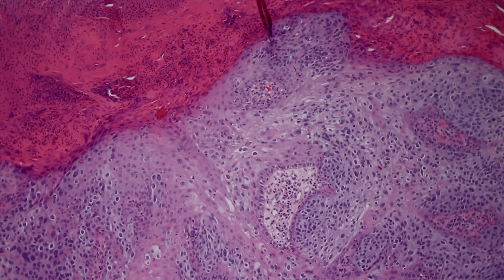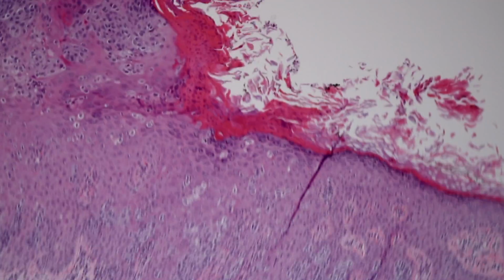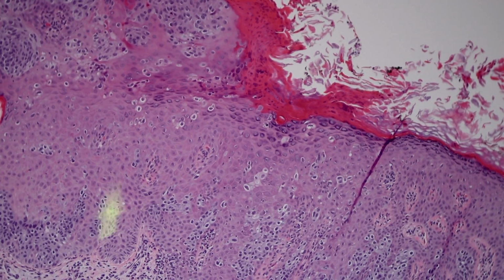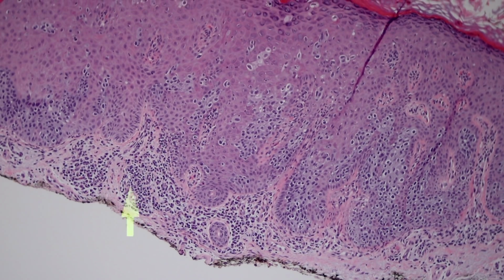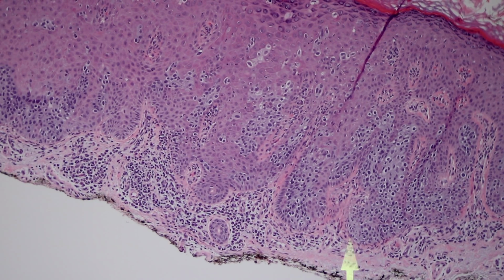And then if we go out to the side, I think it's on this piece, you can see that there's a lot of pagetoid spread. See all the atypical, large, pale, malignant keratinocytes up here. This is pagetoid squamous cell carcinoma in situ. And I feel like it's these squamous cell carcinoma in situs that have pagetoid spread, those tend to be the ones that make that eyeliner sign happen. It's because they spread out like this towards the edge, and then eventually this whole field here will get filled up if we wouldn't have taken it away with a biopsy, and then what will be left behind is just a little eyeliner. So squamous cell carcinoma in situ, eyeliner sign.